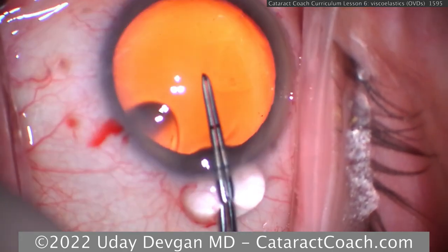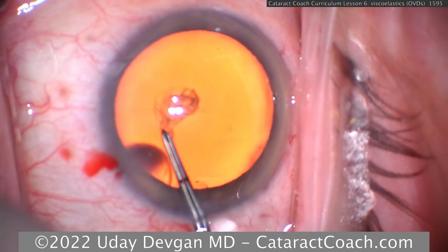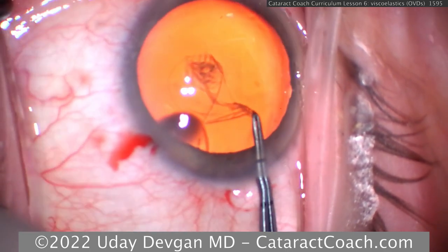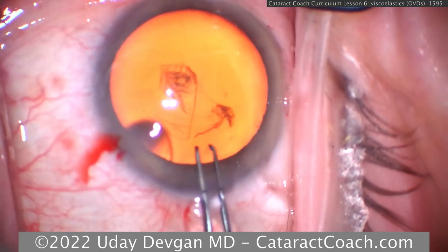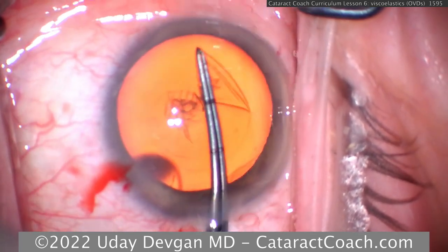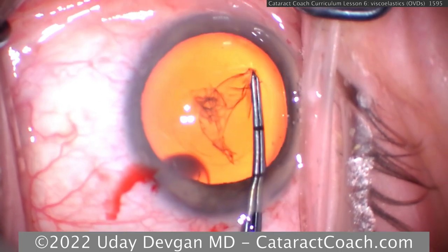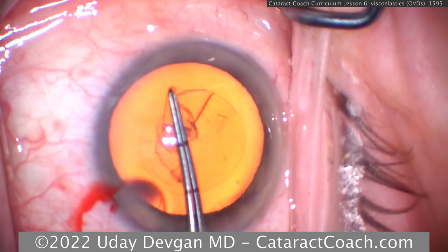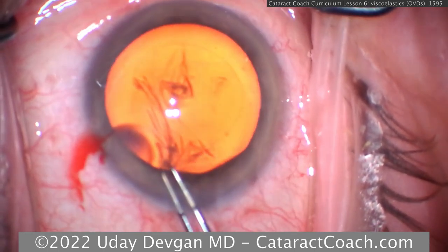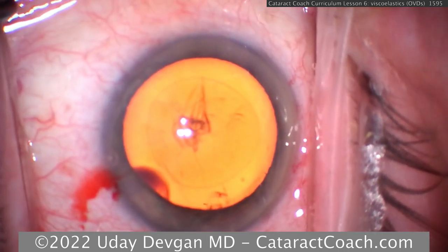Dispersive OVDs have the consistency of honey or syrup or molasses, and they're able to flow like thick liquids. This gives dispersive OVDs the ability to coat ocular structures well. And this coating is not easily washed away by the inflow of balanced salt solution during surgery. This coating of dispersive OVD is helpful to protect the corneal endothelium from the ultrasonic waves and also BSS during surgery. Since it's more liquid than solid, it's also a good choice for lubricating the lens injector cartridge.